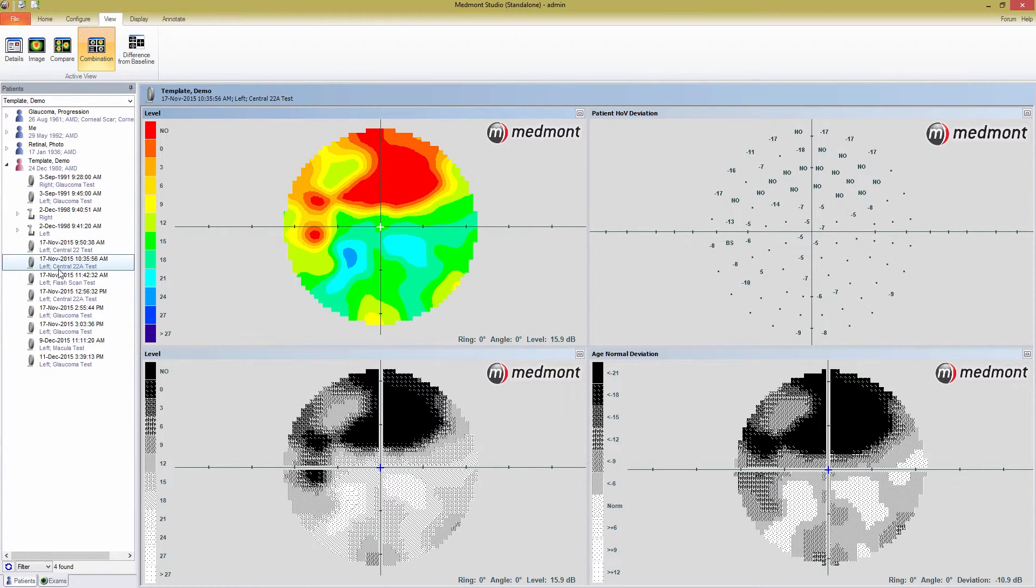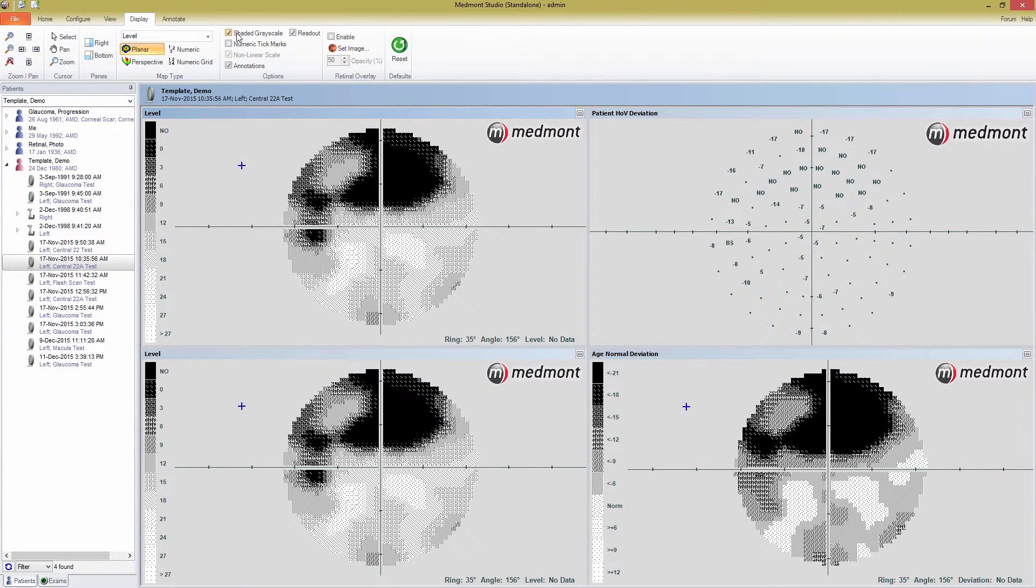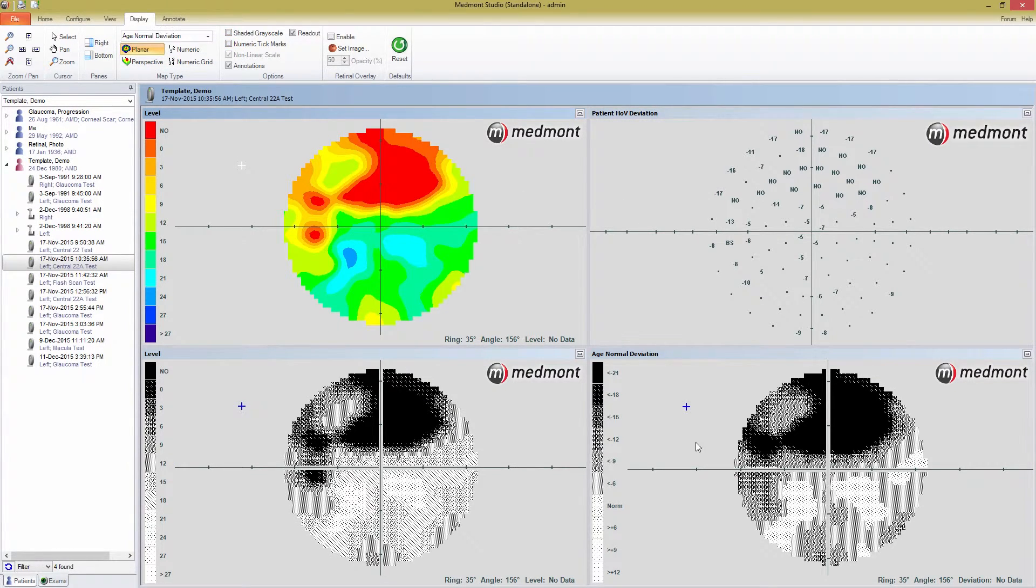If you return to the display tab, you can see that you can use all of the tools we discussed earlier for each map. Simply click on one of the maps and use the toolbar to change the display.